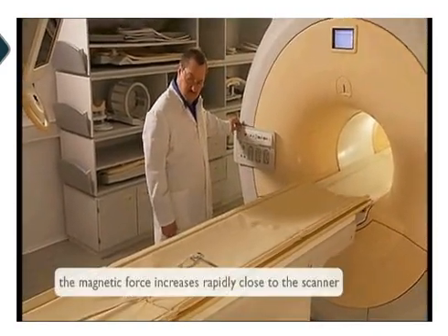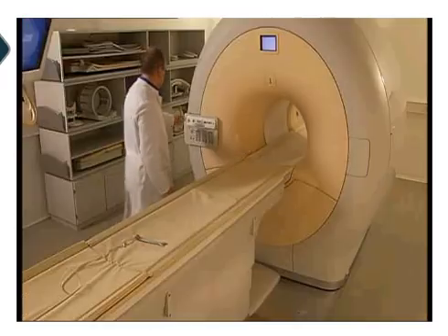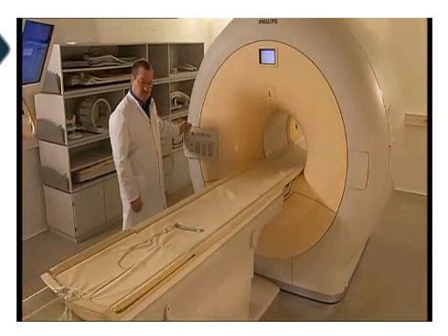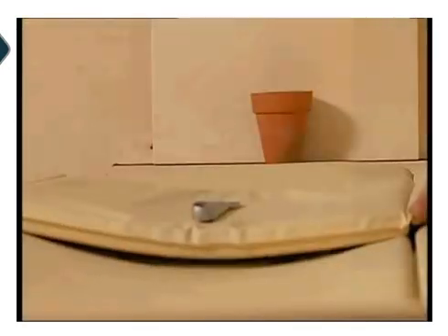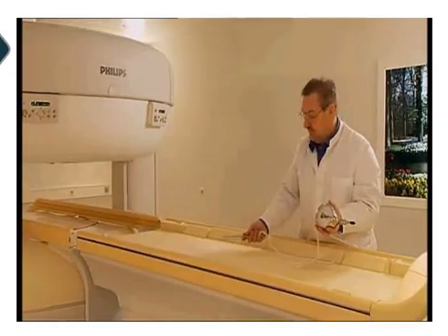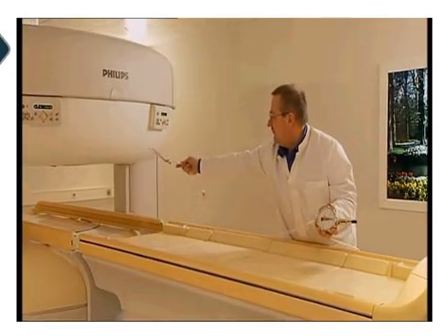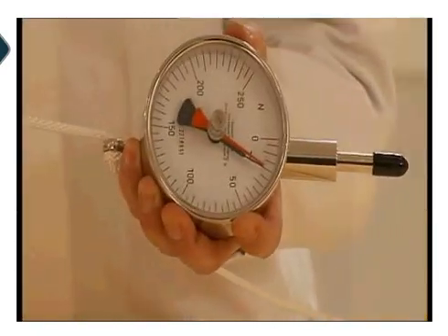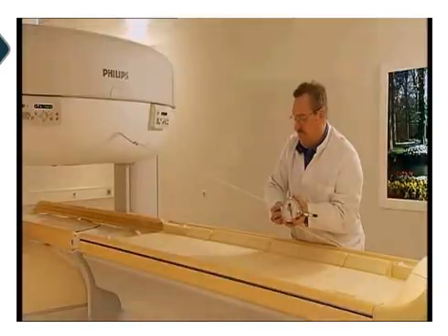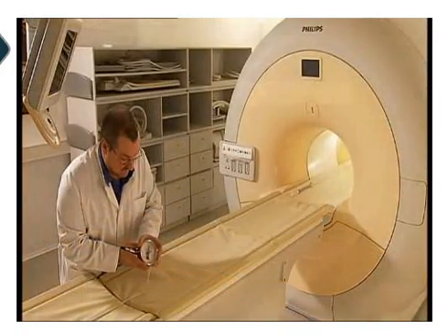The magnetic force increases rapidly as you get closer to the system. If we hold an object a few meters from the magnet, we might feel little force, but closer to the magnet, the forces are substantially higher. This effect is even greater in the case of the actively shielded magnets. These forces are generally higher in the case of open systems, even when the magnetic field is lower than that of a cylindrical system, due to the different design of the magnet.